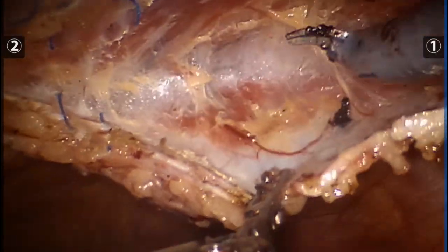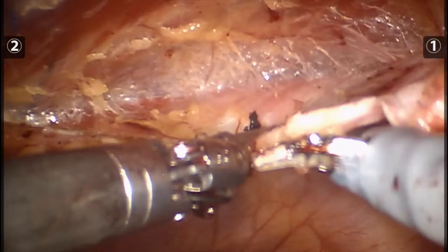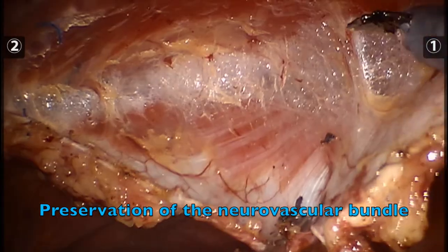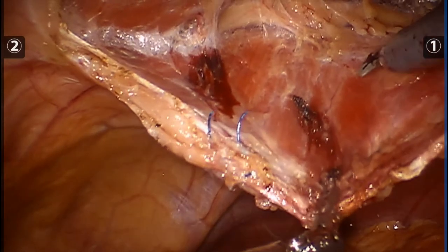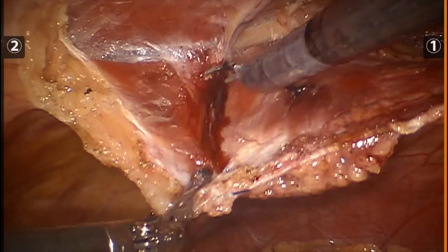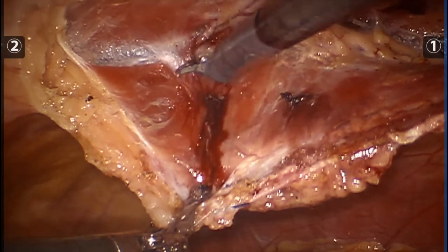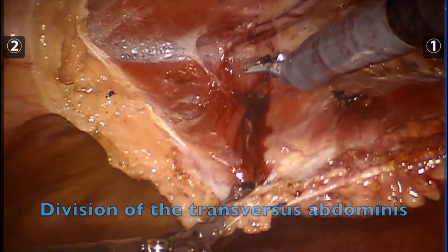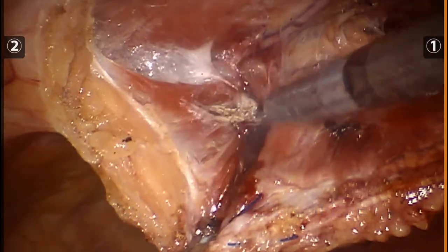Here we start to see the robust fibers of the transversus abdominis in the upper abdomen. The neurovascular bundles are preserved. Utilizing cautery, the transversus abdominis muscle is divided.